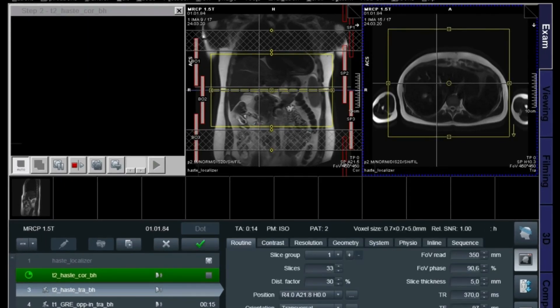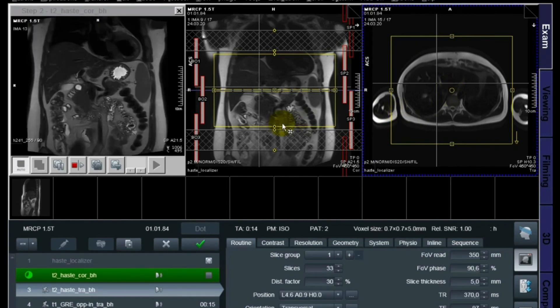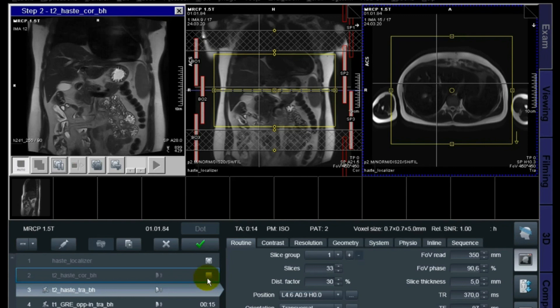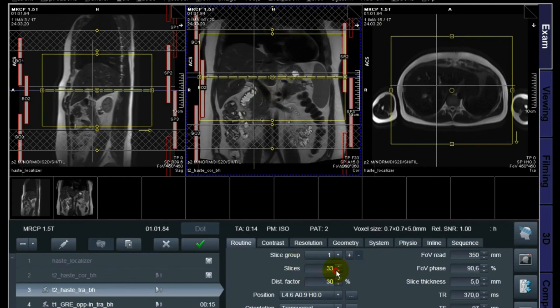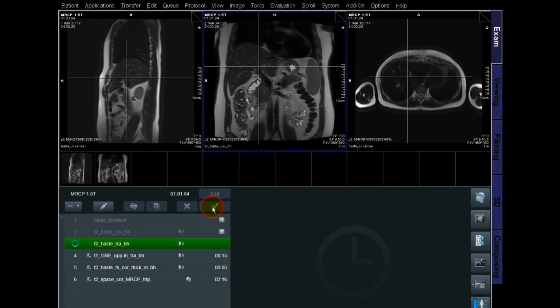While the coronal is ongoing, I'm doing a fine positioning of the transversal. The coronal first breath hold is very helpful because I can see the top and bottom of the liver. I can decrease a few slices to save scan time and shorten the breath hold for the patient — going from 33 to 30 slices, then doing another breath hold.